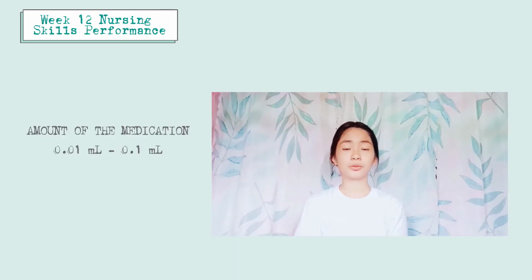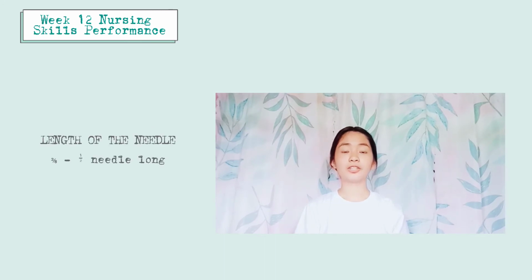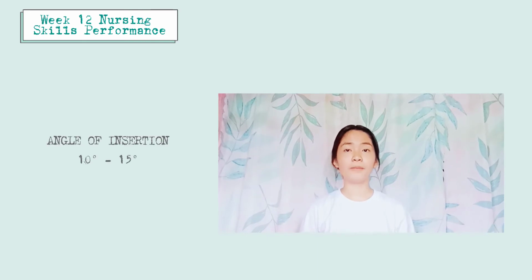When it comes to the amount we give, it usually ranges from 0.01 to 0.1 ml. For the needle gauge, it is 25 to 27. And for the length of the needle, it could be anywhere from 3/8 to half an inch long. So these are little amounts we're giving and little needles we're using. The syringe we use is usually called a tuberculin syringe. And lastly, we give it at an angle between 10 degrees to 15 degrees.